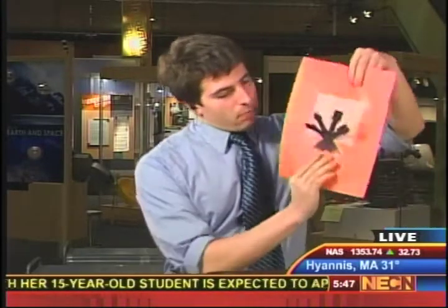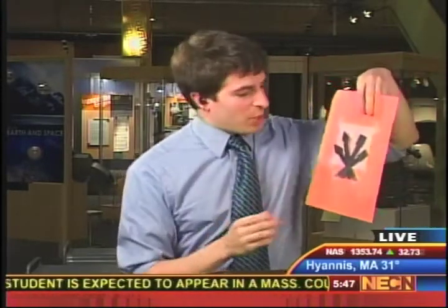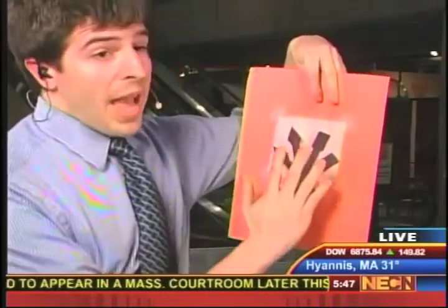How come there are separate channels in the paper? Were they created or are they just kind of there? That is another really good question. So that's basically just so they can control many different tests at once. So I've got a little demonstration that goes along with that. This is basically a large-scale version of their chip, and it's just a piece of paper, and I've got a mask in front of it.